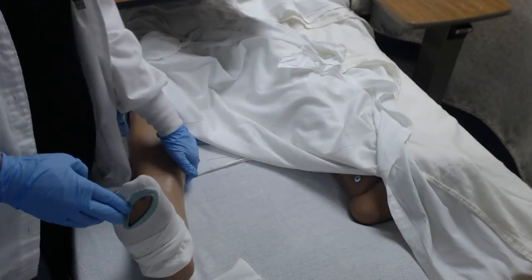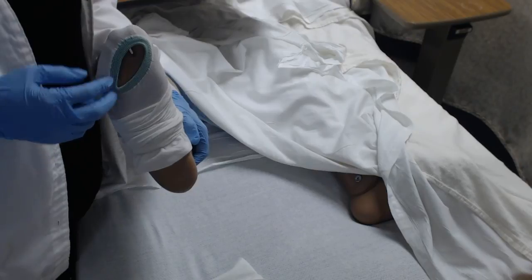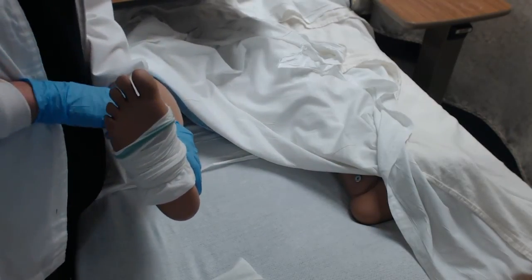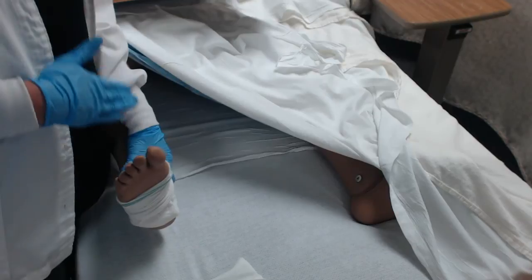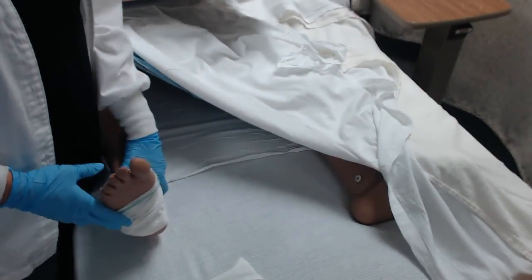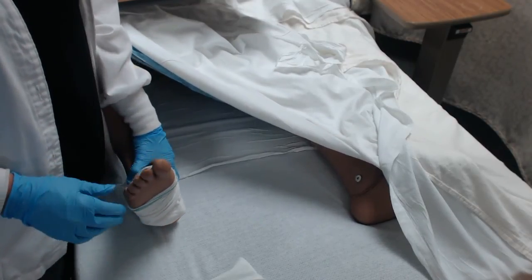This hole is actually what you're going to use to do the post-compression device placement CMS checks. So we did that before we put the device on, and now we can do it after. That's really to make sure that the device isn't too tight and that the patient's tolerating it appropriately.